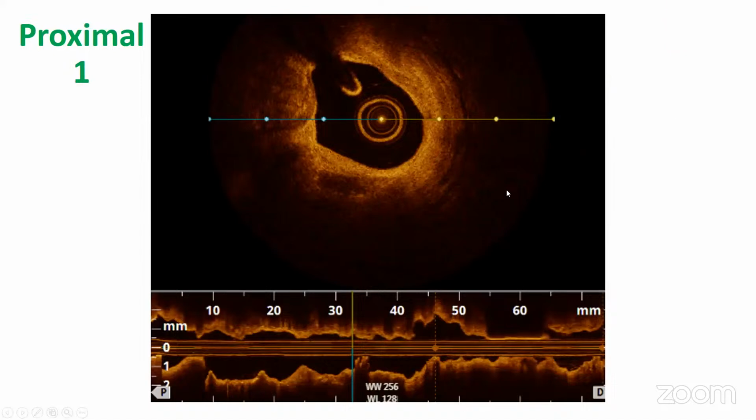Yep. This is great. Well, actually, maybe let's stop with the nodule just a second, because I always think it's a great discussion, nodules. Because to me, I've got to admit that nodules are probably the bane of my life when it comes to coronary. Because I feel like I can treat just about everything else, and then comes the nodule, which is protruding, and I never really know what to do.